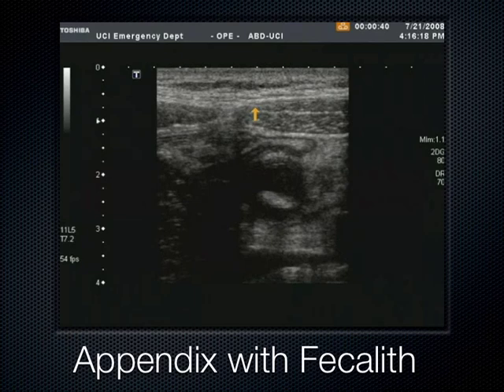There are risks that you can do to patients with ultrasound, such as dislodging a DVT. That does frighten me, but compressing an appendix, I don't think there's enough extrinsic pressure that you could perforate it. I think really the true perforation comes from the inside getting ready to make it pop. Because yeah, we're pushing a lot of pressure, and maybe I oversold that too much. We're not pushing so hard that we're causing a very local part of it to perforate. I mean, we're pushing enough just to kind of get the muscle bellies to come together.